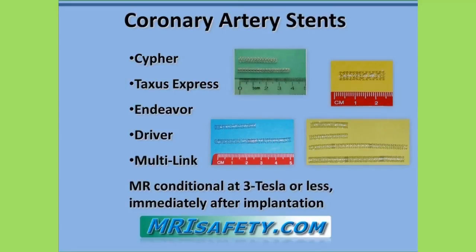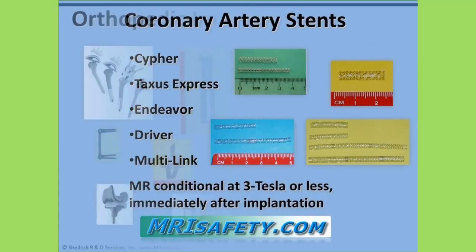Many other bare metal and drug-eluting coronary artery stents have also undergone similar MRI evaluations to support MRI labeling claims. This information may be found at the website MRIsafety.com as well as at other websites for the respective manufacturers.